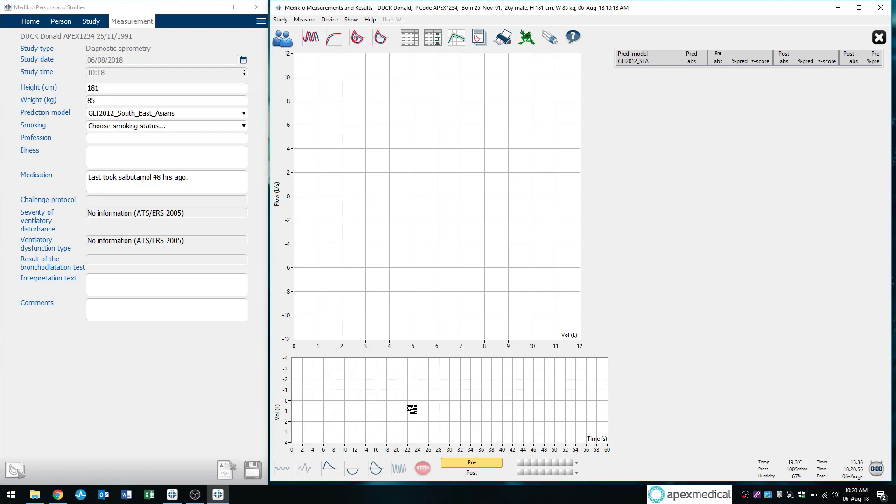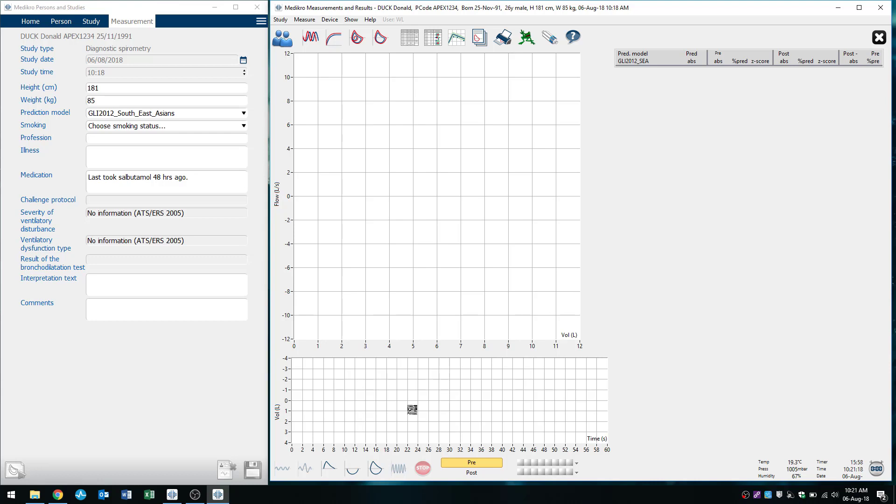So remember, always instruct your patients before performing spirometry, just so they have an idea of what they have to do. Normally, I would recommend the patient to start with their lips nice and sealed on the mouthpiece, tidal breathing. And after two or three breaths, I'll ask the patient to take a big breath in as much as they can before blasting that air out as fast as they can for as far as they can.